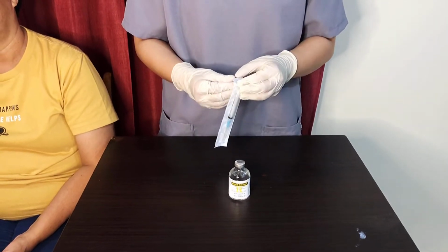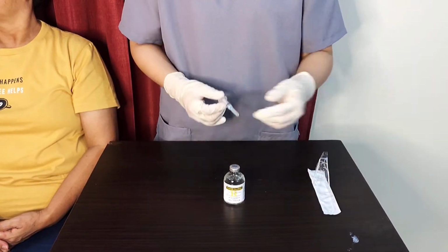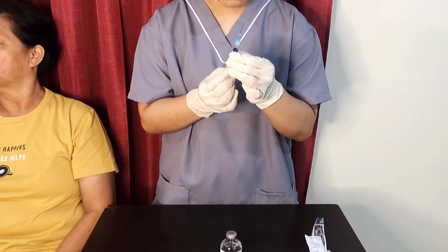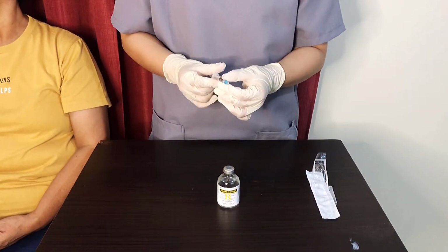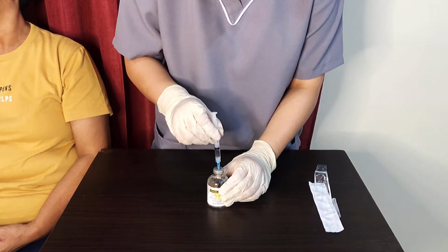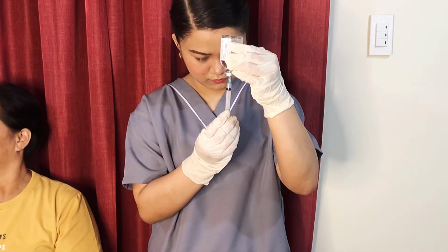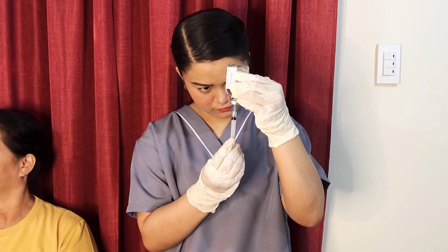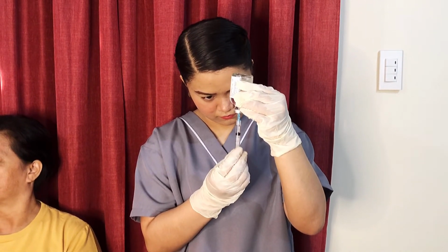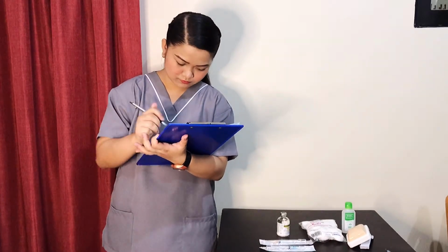At first, you must prepare the medication or solution. And always compare the physician's orders with the MAR.